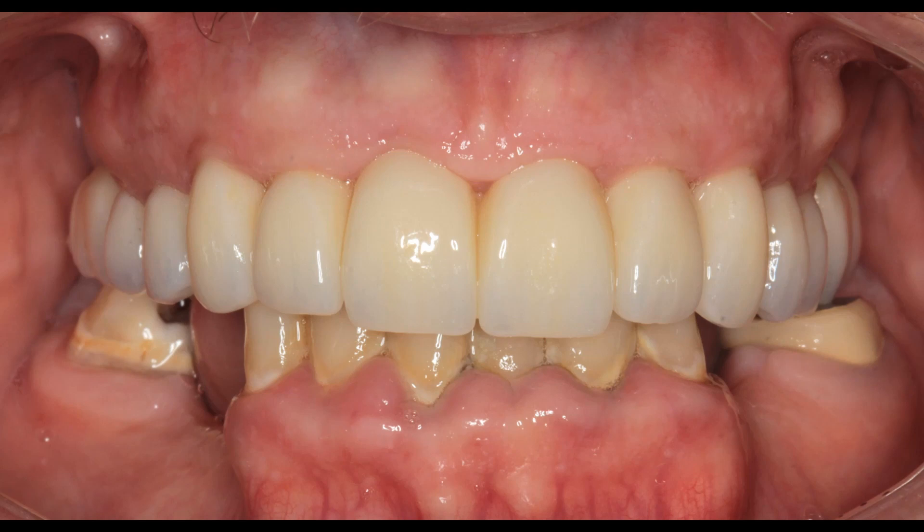Here is the lips-retracted final outcome view of this patient's new upper implant bridge. He was pragmatic enough to allow us to add natural character to his teeth. You'll also see how beautiful his smile is in his normal portrait picture. In this photograph, I'd like you to note that we've maintained that soft tissue architecture I talked about from the first slide — and that is what gives these treatments such an amazing natural look. That's always been our goal, but it takes time and energy to get there.